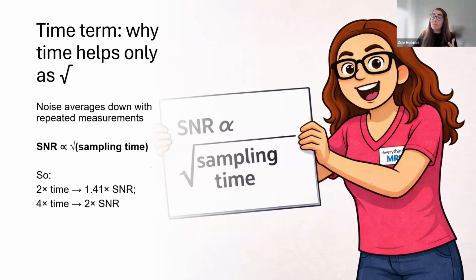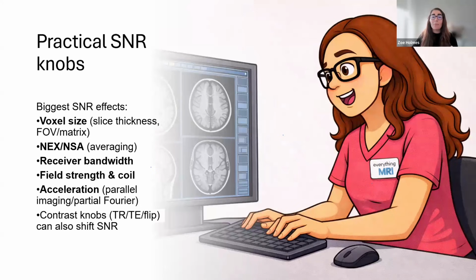You're better off to have an image with a little bit of grain and noise versus an image that is completely of no diagnostic yield due to motion artifacts. Think about the clinical question. It always comes back to that.